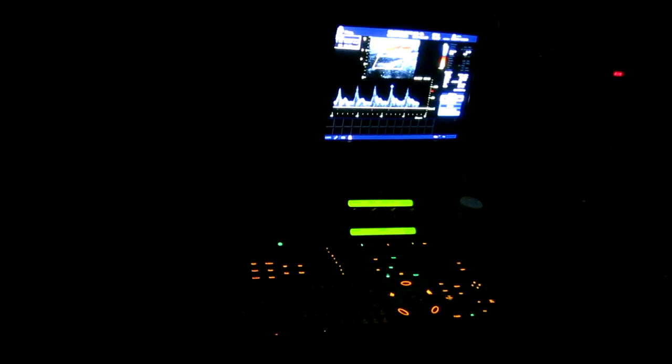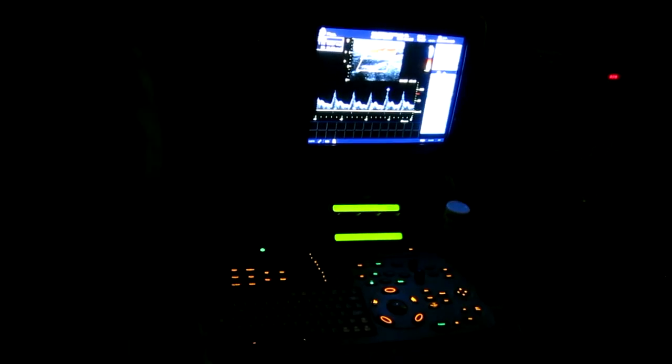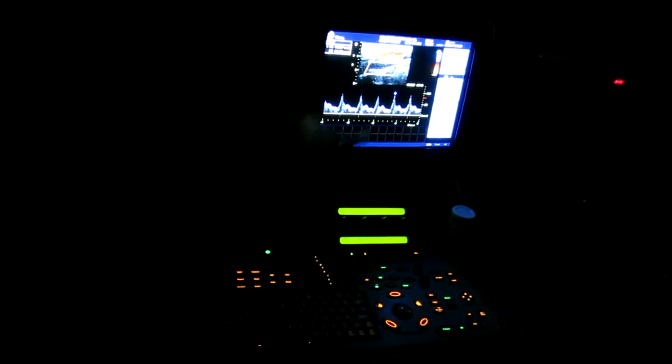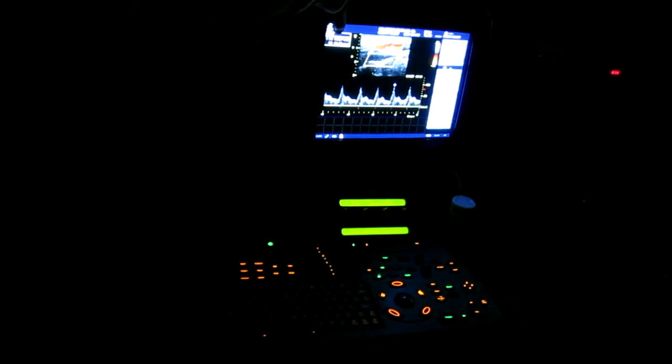Very nice. And it actually has a nice feature on it for you. I'm going to freeze this. So this is her pulsatile carotid flow, and it tells you what the velocity is at peak, systole, and end diastole. That's what these stand for.